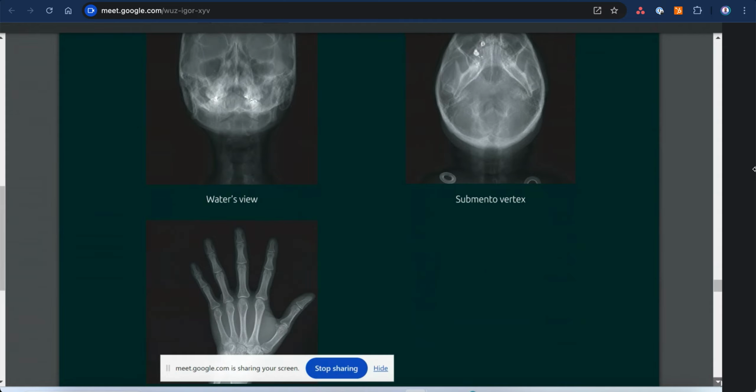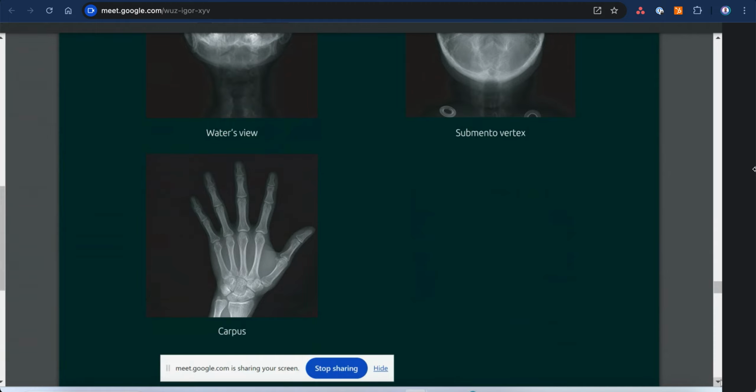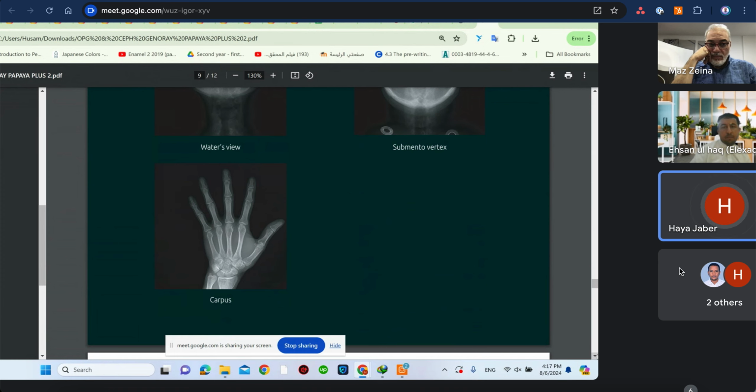And this is for hands. This is especially important for orthodontists. Why do they take a picture of the carpus of the hand? Because it is indicated scientifically that I can know from the bone of the hands whether the growth has stopped or not. I want to make sure that I can do orthodontic treatment without going into surgery. I can just get a picture of the carpus, which is the hand, to ensure that growth is going on, so there is an opportunity to do orthodontic treatment without surgery. But if the growth has stopped, I can't go orthodontic, especially if there's a problem in the bone here. So I must go into surgery.